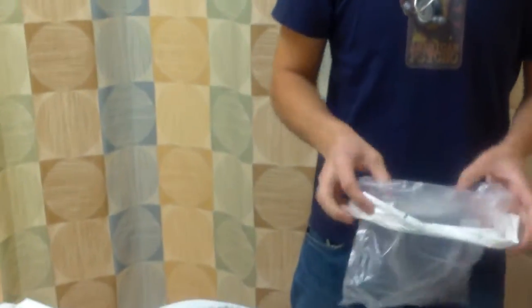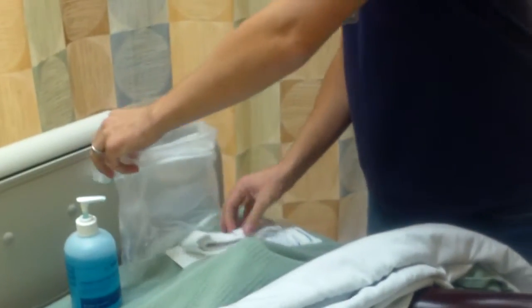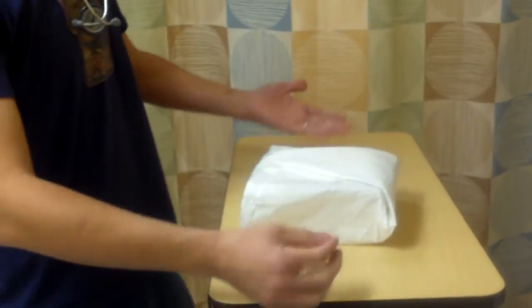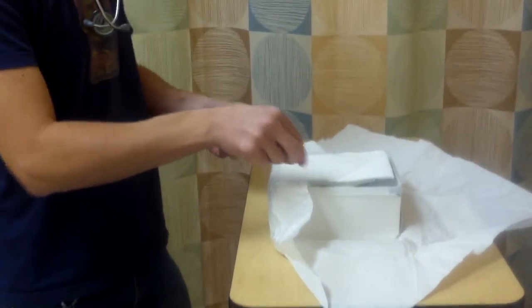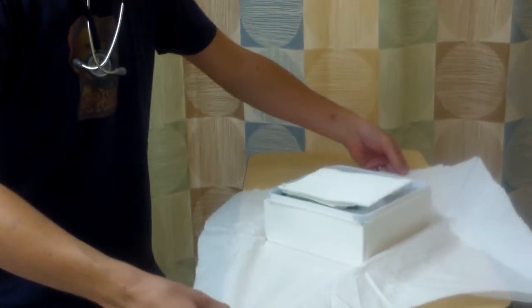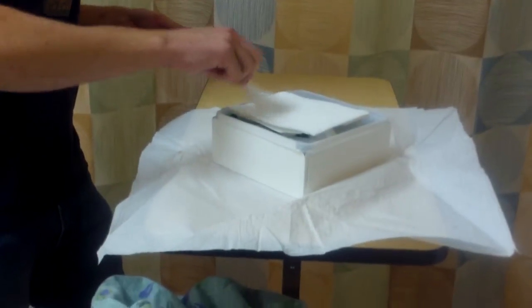There we go. This is going to be my makeshift garbage. Okay. That there. Alright. Now I want to open my package away from me. Okay, I'm going to touch the outer edge and rotate. Alright, there we go. And then I'm going to grab my sterile drape, touching the 1 inch.